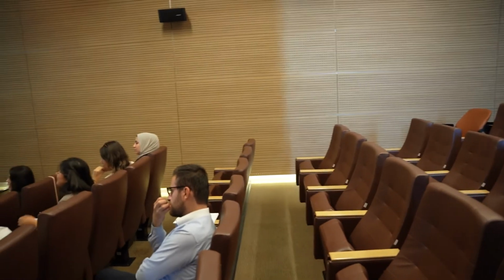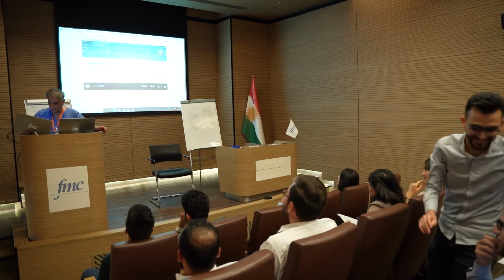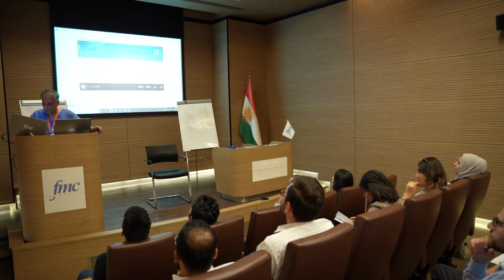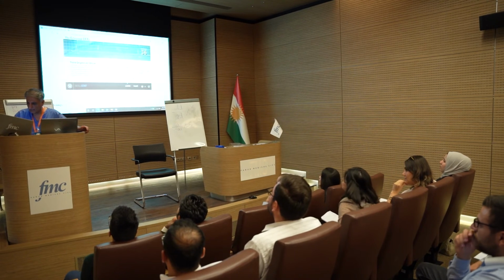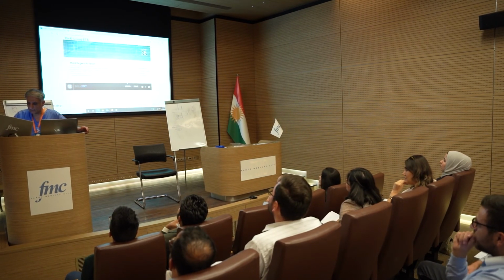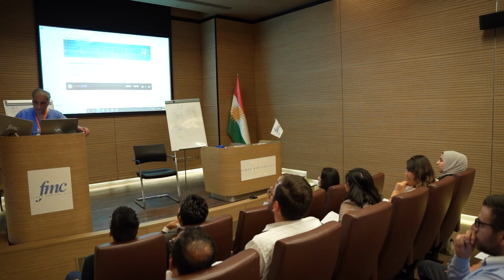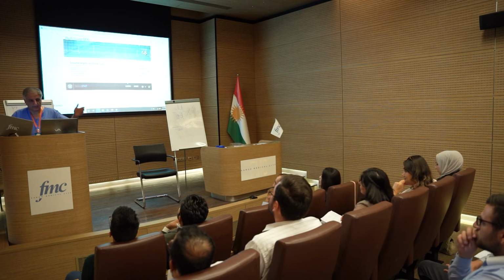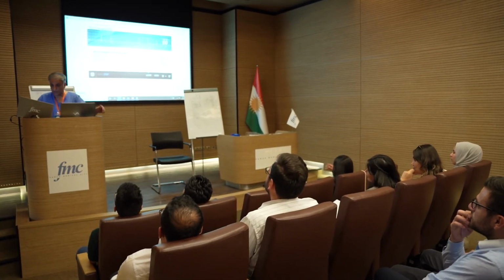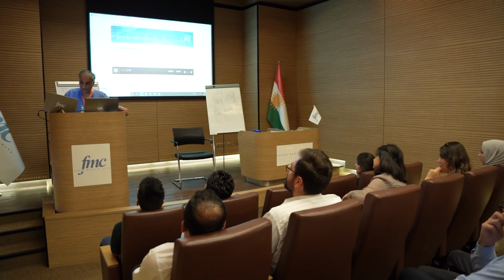Can you please go through type 2 heart block? Let's go through the blocks basically. Type 1, which we've done, is the successive Wenckebach, the successive prolongation of the PR interval. And then there's another type, second degree AV block, type 2.